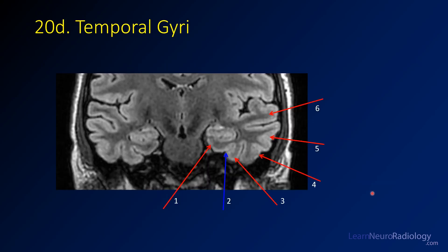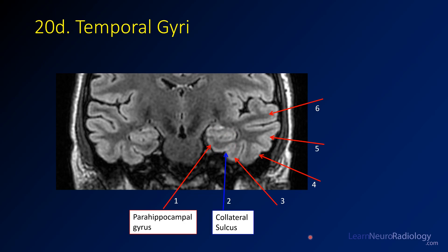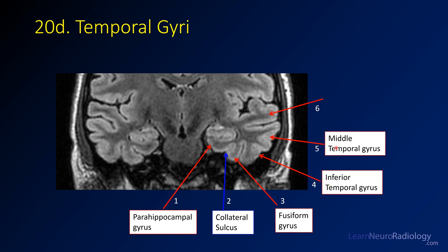Now we'll move to the coronal visualization of the temporal lobe. These structures are named starting medially and then rotating around. This one is the parahippocampal gyrus, which makes sense because it's closest to the hippocampus. In blue, we have a named sulcus you should probably know — this is the collateral sulcus. The next gyrus is the fusiform gyrus. And then these three, much like the frontal lobe, are very intuitively named: the inferior, middle, and superior temporal gyri.